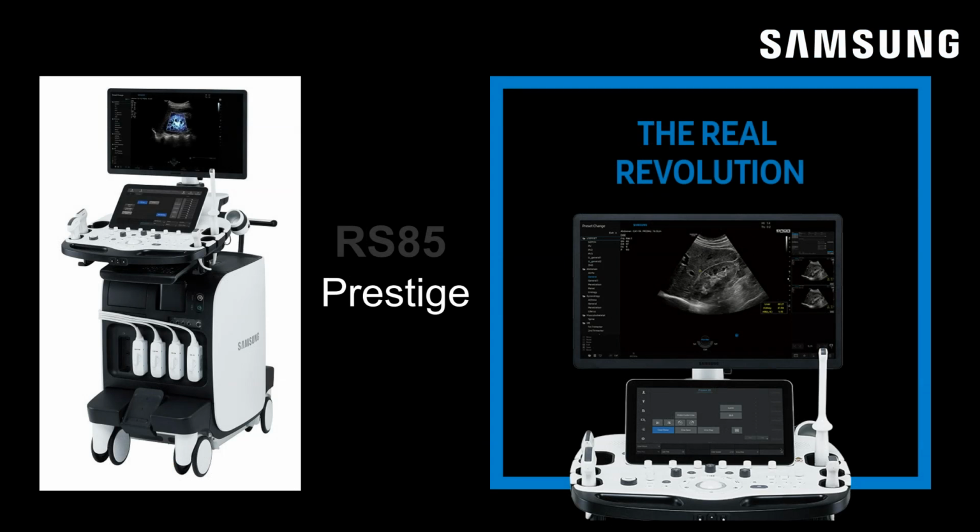I'm going to show you 3 cases of acute cholecystitis, including gangrenous and emphysematous cholecystitis, and I'll highlight key teaching points throughout. All right, let's start with the first case.